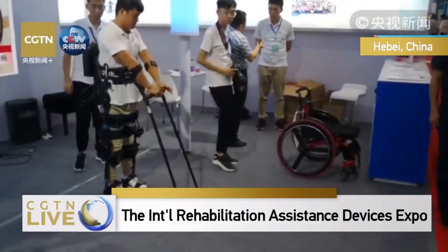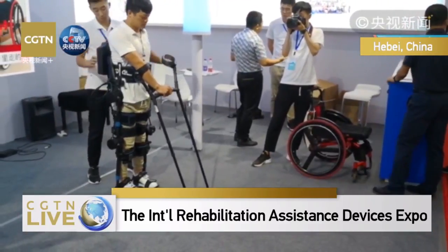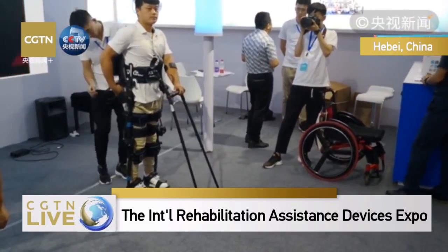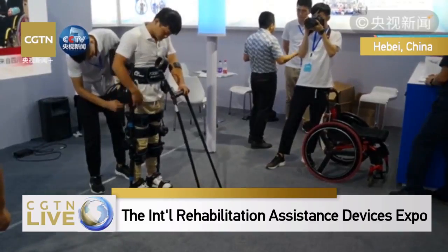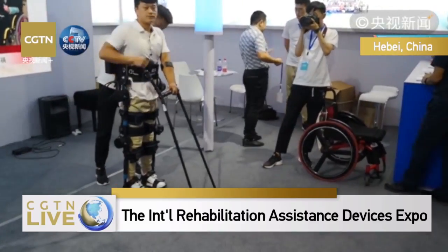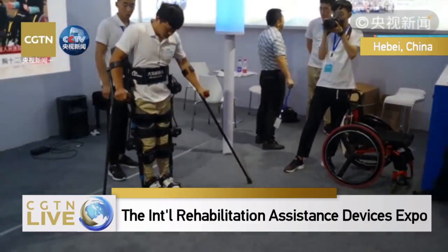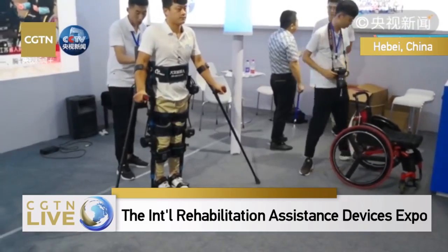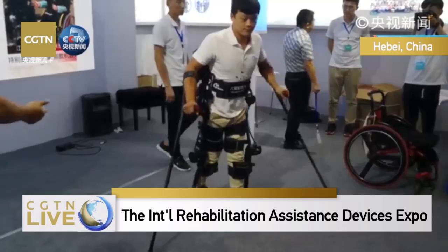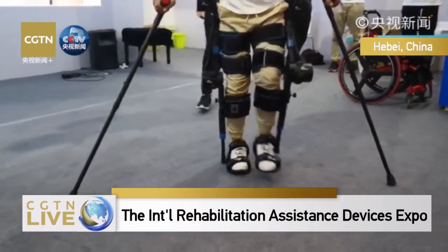This weighs about 20 kilograms, but will not feel too heavy on a patient because this machine touches the ground. Most of the weight is on the ground instead of on the patient. And it's made of a titanium composite, and it is already very lightweight.